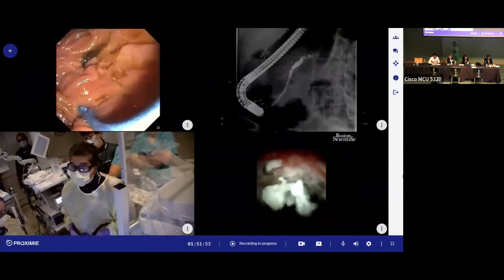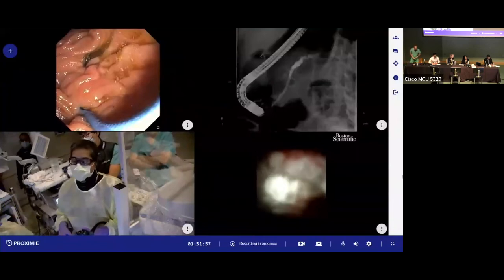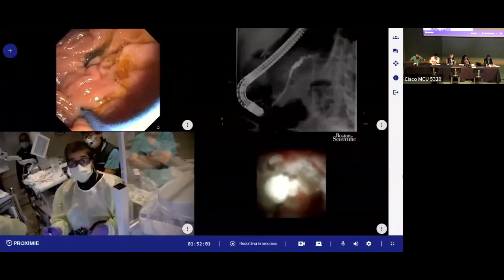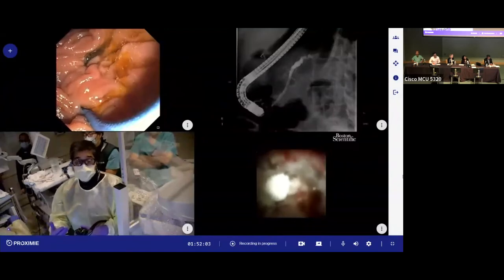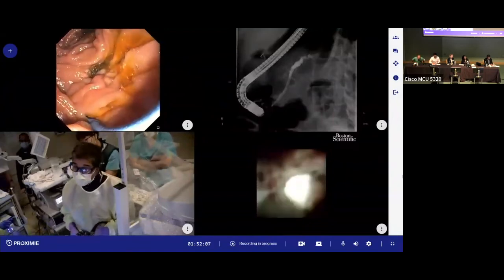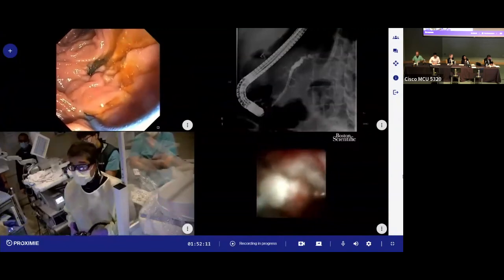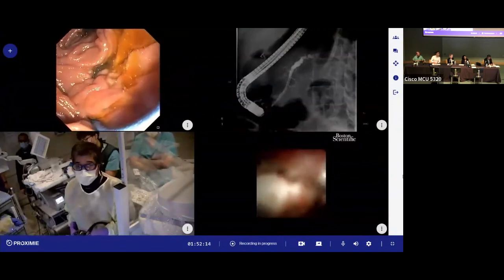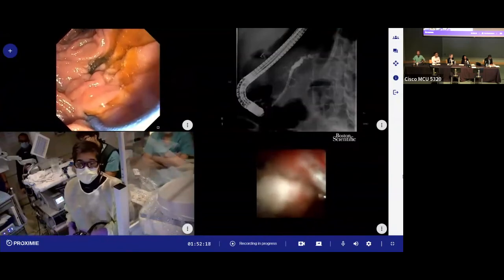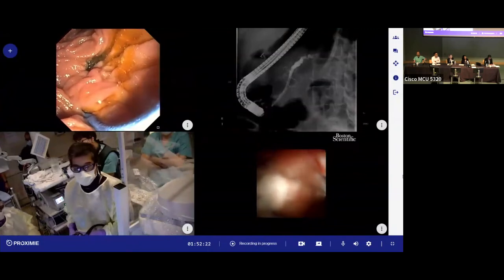That's right. Now, sometimes I've had cases where you have large stone fragments and the stent is pushing up against those fragments and causing pressure on the duct, so they can still have pain. That's a possibility. I'd give them the benefit of the doubt. I try to clear the duct if possible. And then, of course, if they're still not improved in pain, then you go to the neuropathic type of medication. I don't know if I answered the question you asked.